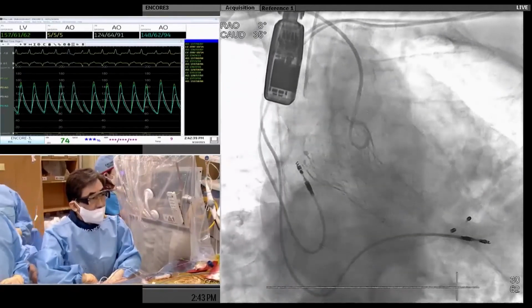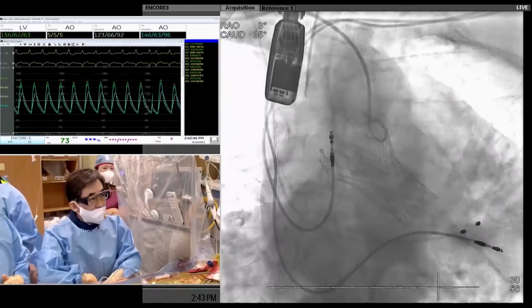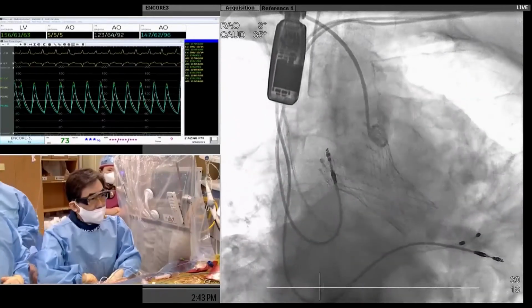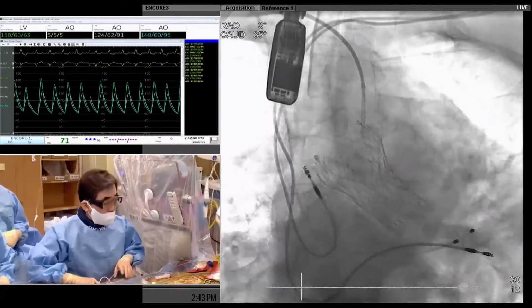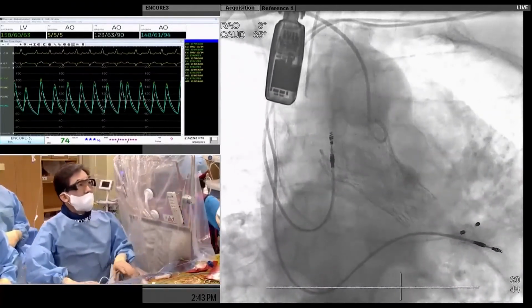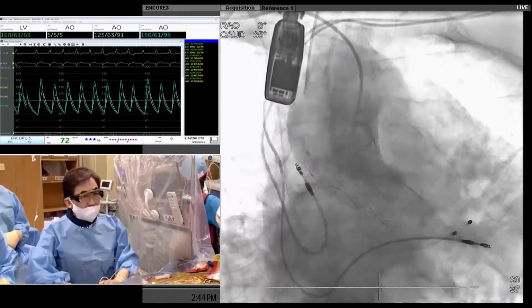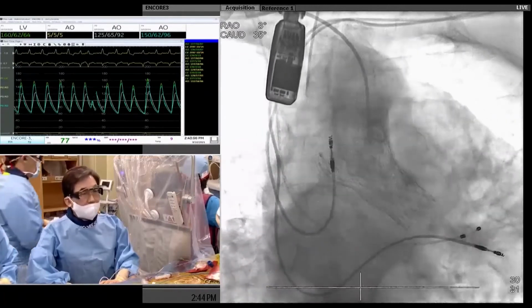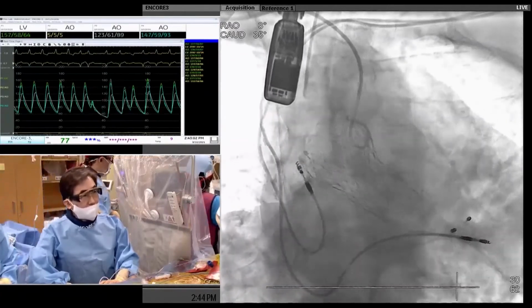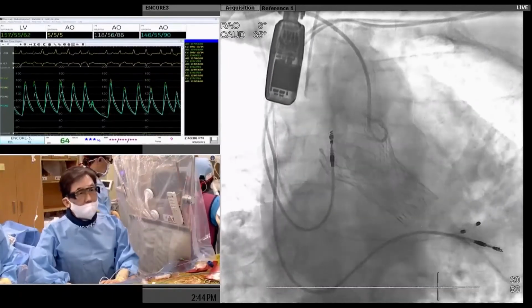Okay, coronary flow is no problem. Once again, echo. The pressure profile is good. Pulse pressure is not wide, but echo is too sensitive. Echo tells us there is a moderate degree regurgitation, but actually hemodynamics, pulse pressure, and angio show it is negligible.